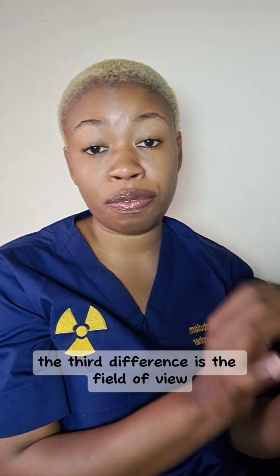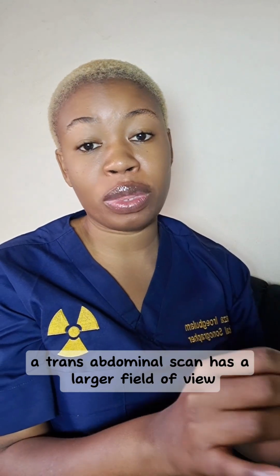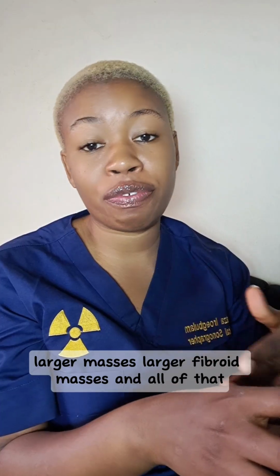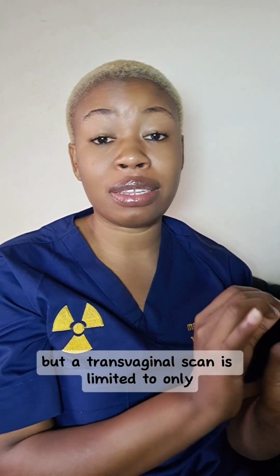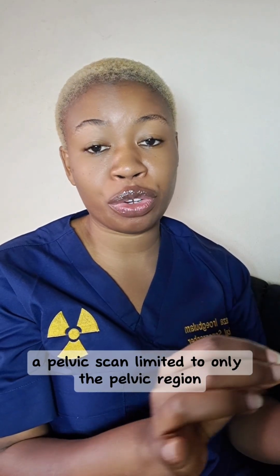The third difference is the field of view. A transabdominal scan has a larger field of view. That means it can cover the general abdomen, larger masses, larger fibroid masses, and all of that. But a transvaginal scan is limited to only a pelvic scan, limited to only the pelvic region.